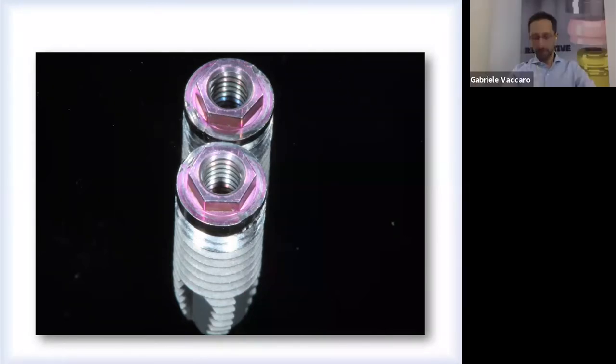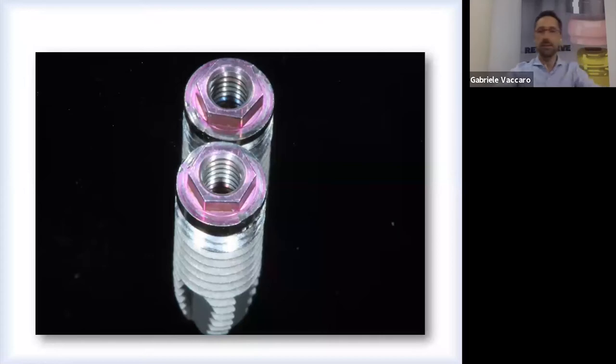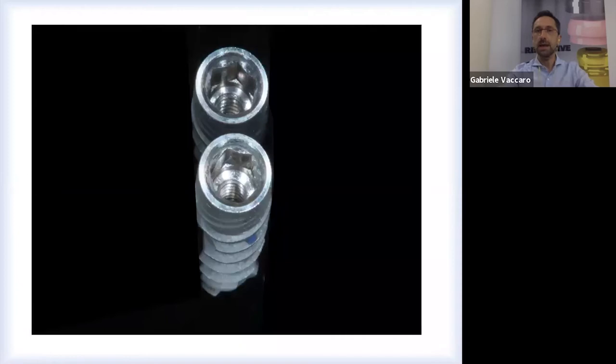So, reviewing the literature, I can say that using this in the beginning for the single tooth was an improper use. In fact, the market then came out with a stronger connection between abutment and implant. They started to make a bigger screw hole, a bigger hexagon, and then in the 90s the internal connection came out on the market.